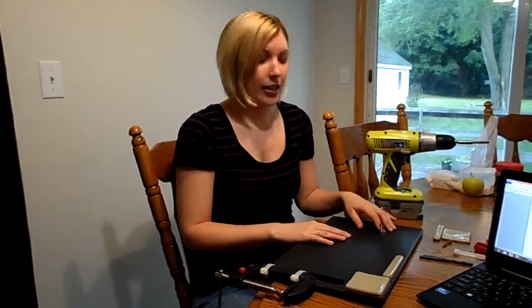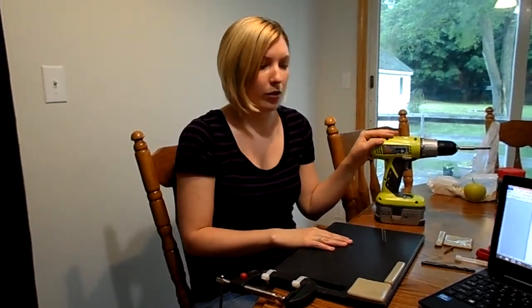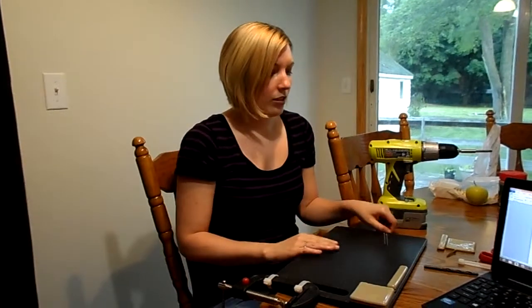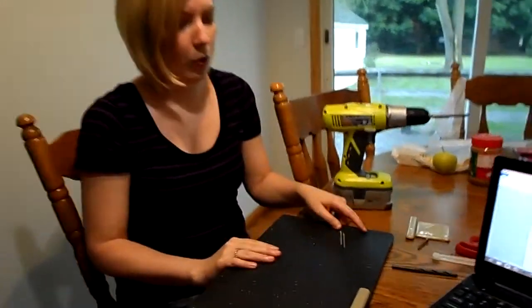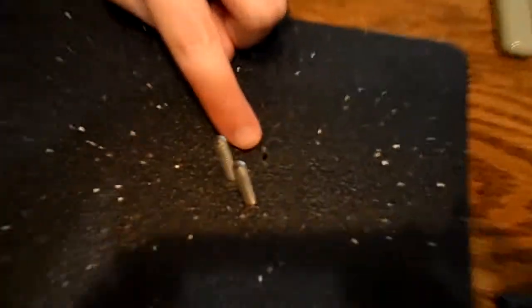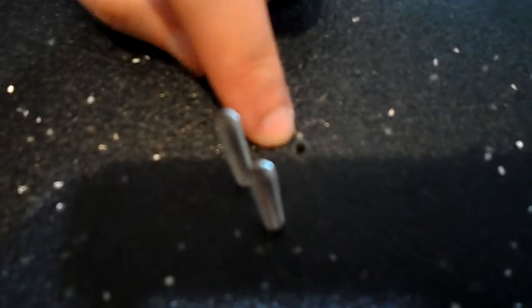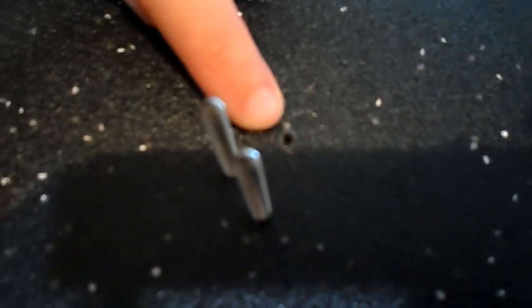And once I did, the first thing you're going to want to do is drill with your electric drill 3 holes using your 7/64 inch drill bit. So as you can see, I've drilled a hole here. And then once you have drilled all 3 holes, it will be ready to accept the screws.